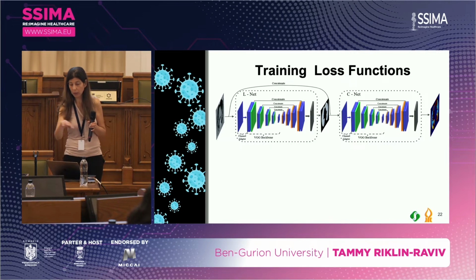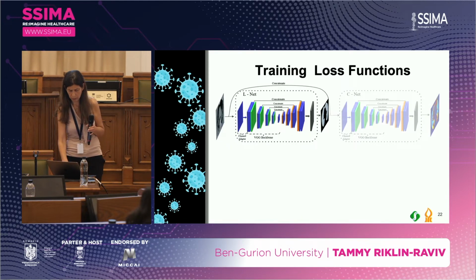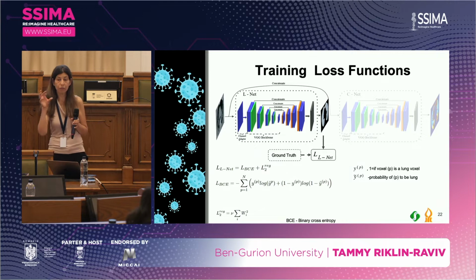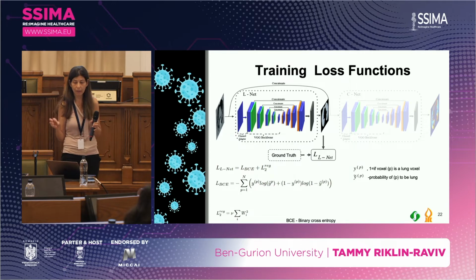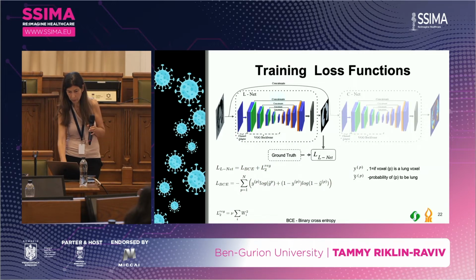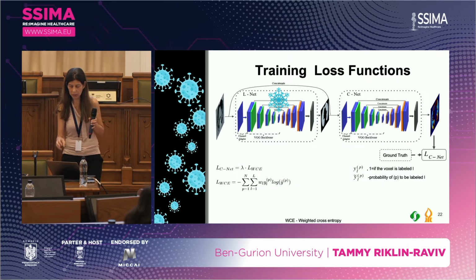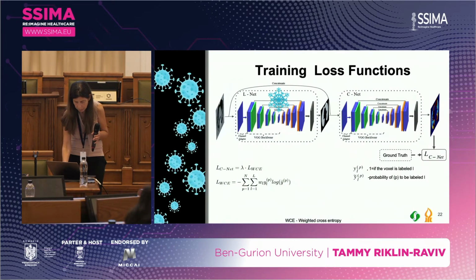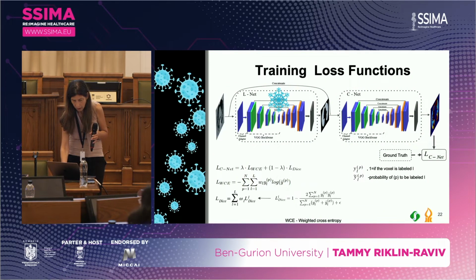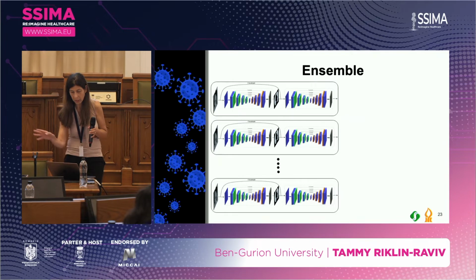As for the loss function, the hierarchical network compound was trained end-to-end. We use binary cross-entropy for the first part of the network compound, which is the LungNet, LNet, and we use categorical cross-entropy for the CNet. Altogether, there was an interplay between the two networks. They were trained end-to-end, but the algorithm freezes part of the network at a time. We also use the dice loss and regularization, but these are just technical details.